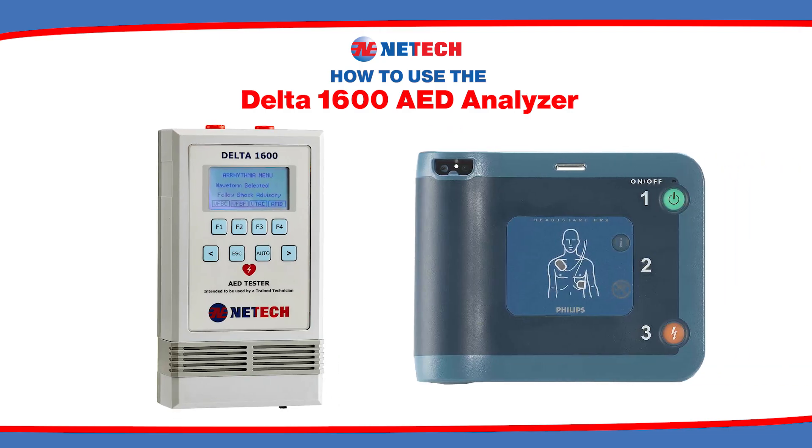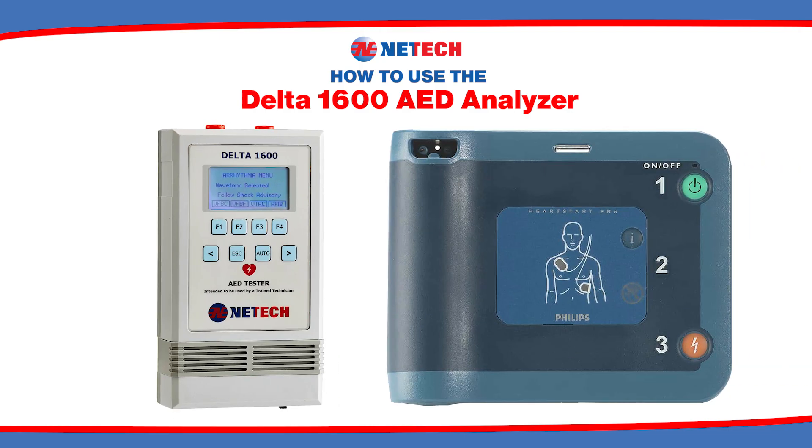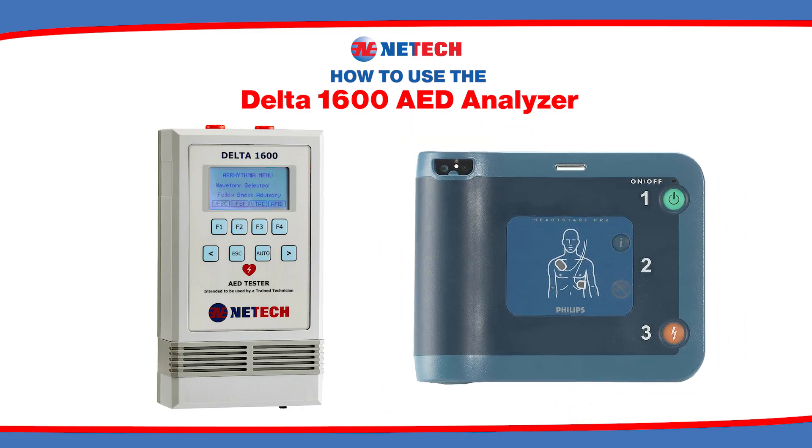Lastly, follow the operating instructions and the audio response of the Philips Heart Start AED to complete your test. This procedure can be performed with all AEDs.